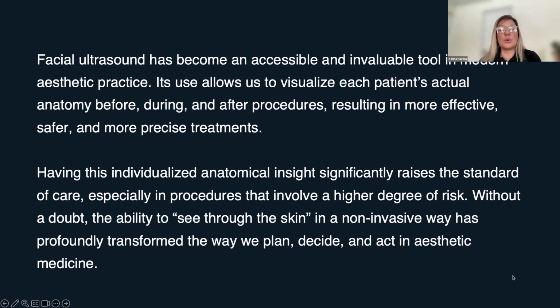And to conclude, facial ultrasound has become an accessible and invaluable tool in modern aesthetic practice. Its use allows us to visualize each patient's actual anatomy before, during, and after procedures, resulting in more effective, safer, and more precise treatments.